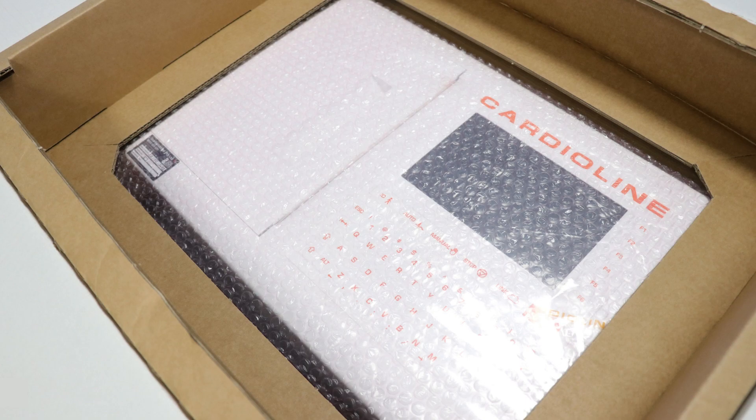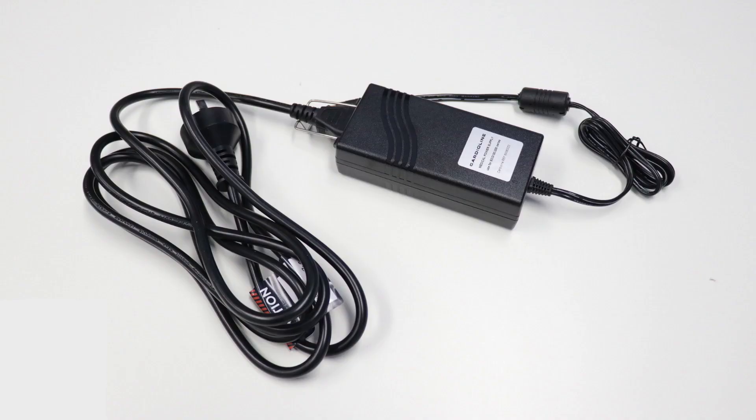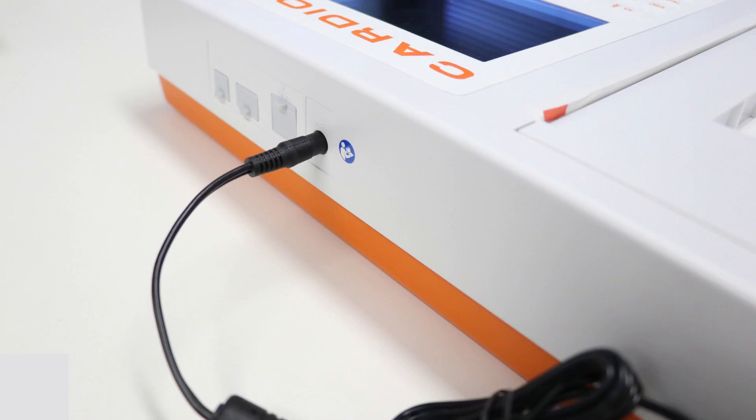If you remove the accessories box, you will see your ECG device located underneath. Remove the ECG from the protective bubble wrap and place it on the table. You should now have everything ready to set up your device. Take both black power cables and connect those together, then on the back side of the device, behind the screen, locate the power plug and insert the power cable into the CardioLine unit.